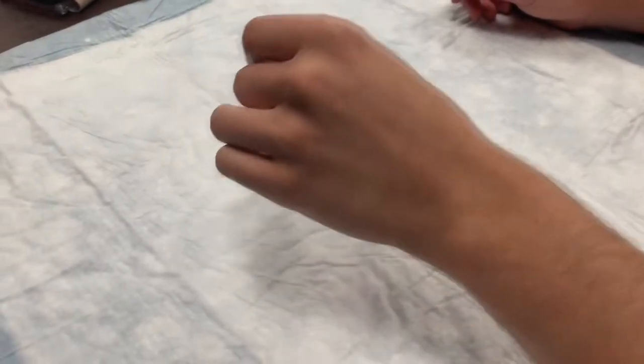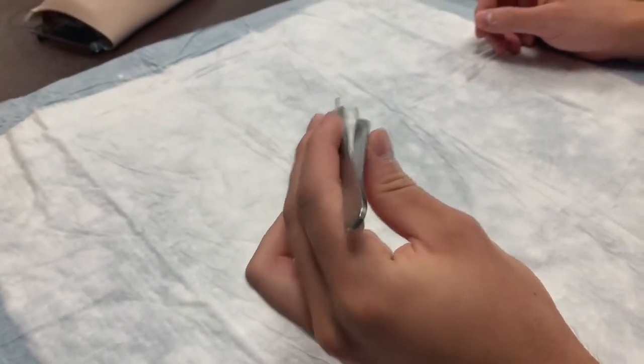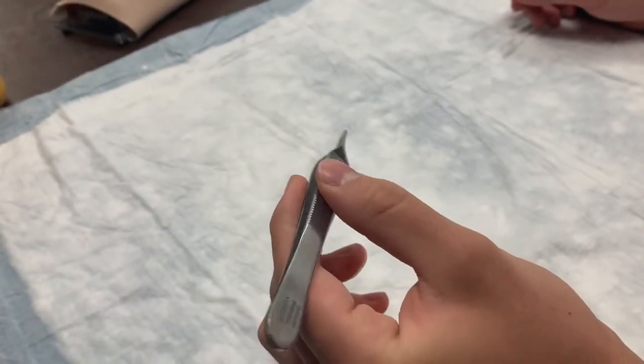You hold forceps similar to a pencil, with your thumb on one side and your second and third fingers on the other side. Notably, you want the back of the forceps to rest on the top of your hand.